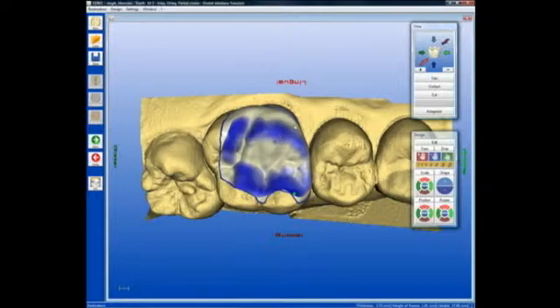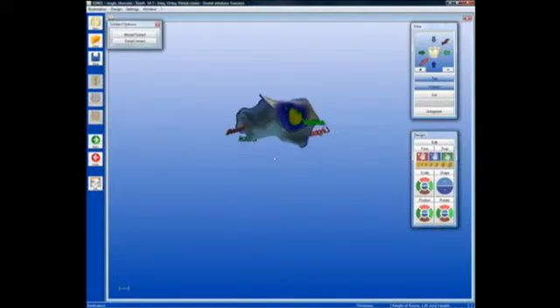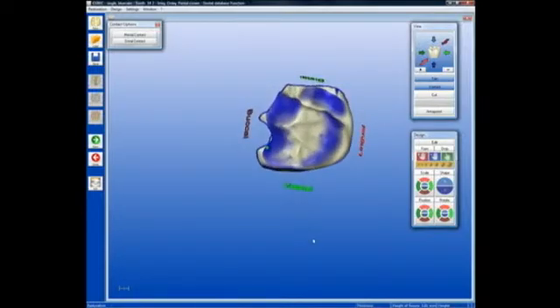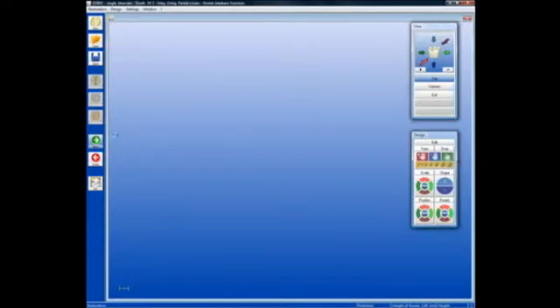We can take a quick look at the contact area on the interproximal and verify that we are happy with the thickness, the width, and the strength of that proximal contact. This restoration is now ready to mill. So let's mill this, and then we'll do a dry try-in before any finishing of the restoration and bonding. It's time to go to the milling preview and then begin the milling process.